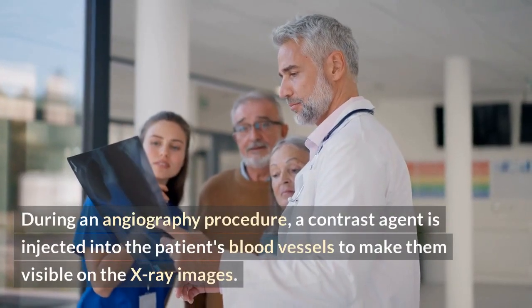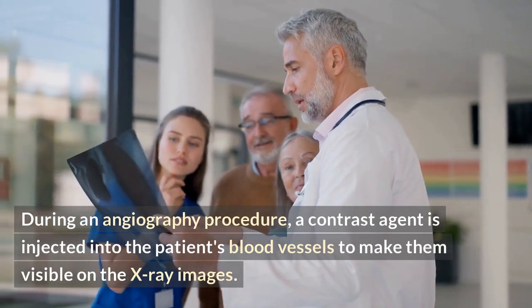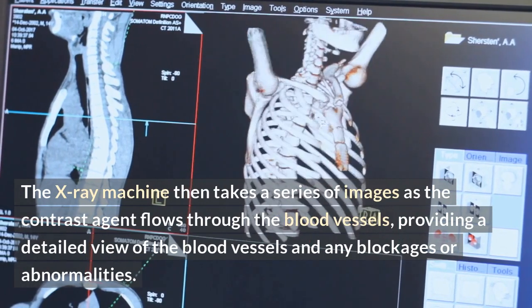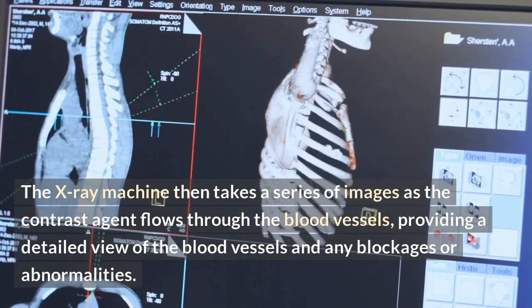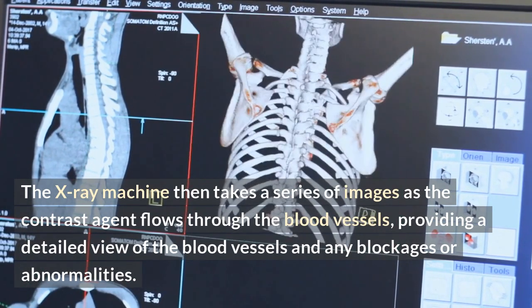During an angiography procedure, a contrast agent is injected into the patient's blood vessels to make them visible on the X-ray images. The X-ray machine then takes a series of images as the contrast agent flows through the blood vessels, providing a detailed view of the blood vessels and any blockages or abnormalities.